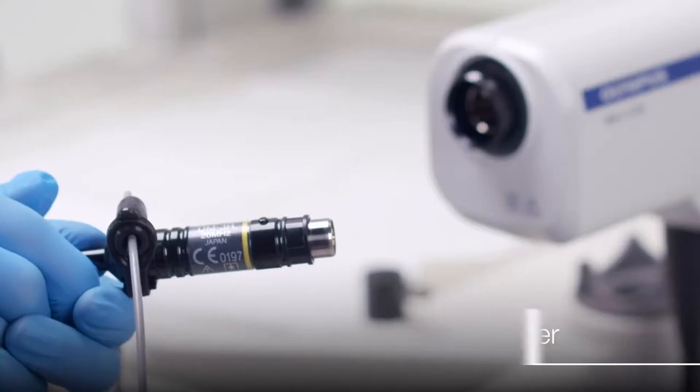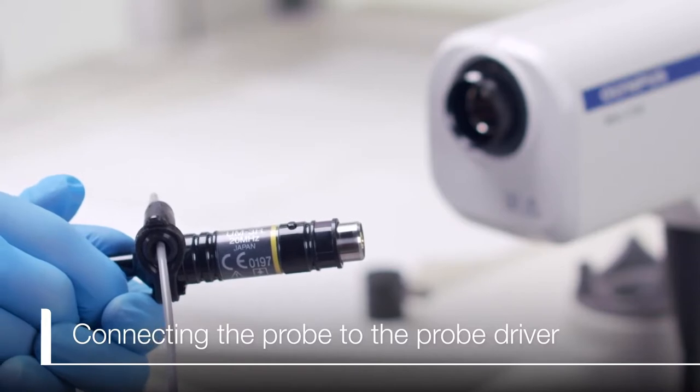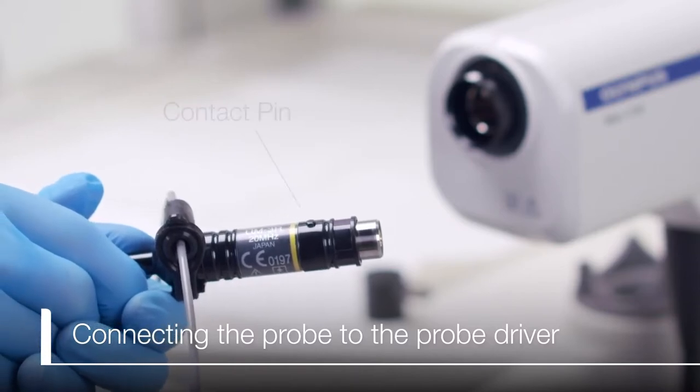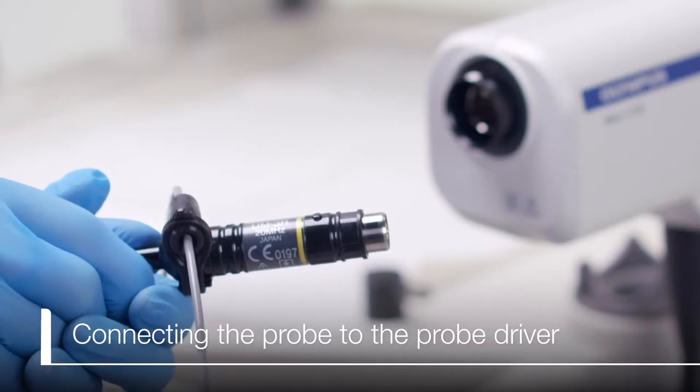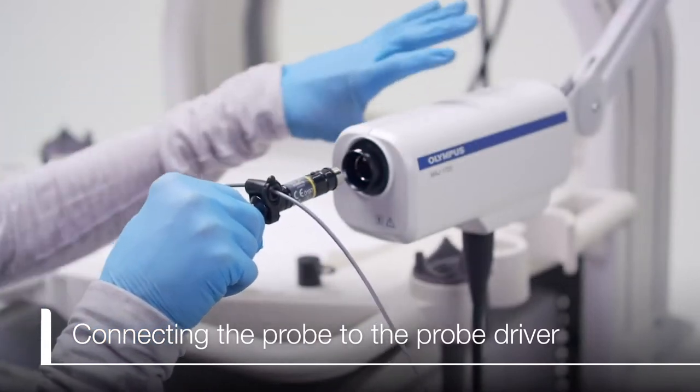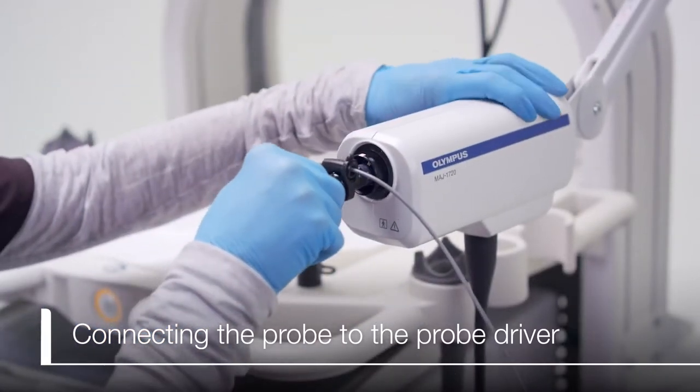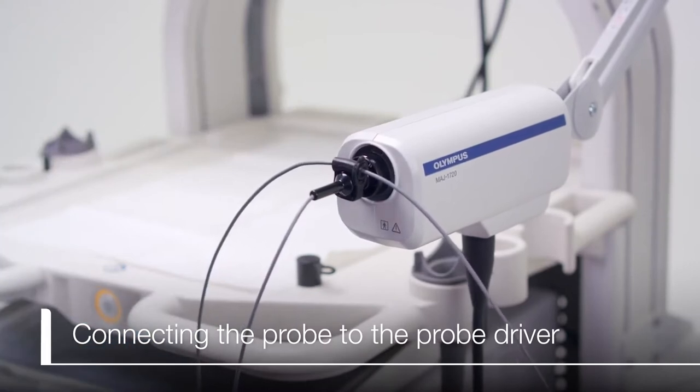Now that we have covered proper storage and components of the probe, let's demonstrate how to connect the probe to the probe driver. The probe connector has a contact pin. The probe driver has a groove in the top of the internal cylinder. With the contact pin facing up, align the contact pin to the groove and the connector should easily slide straight into the probe driver. You should not have to force it.